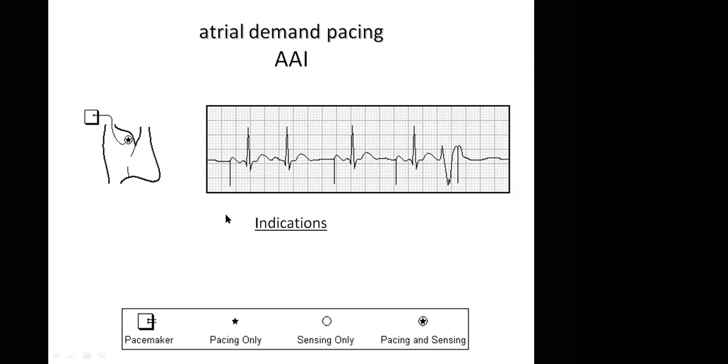I'm not too sure. Maybe the upward line after the pacing, is it a T or a P, or is it the P that is very close to the QRS complex? Dr. Oladimeji, we need your help. It's a T. It's a T, right?